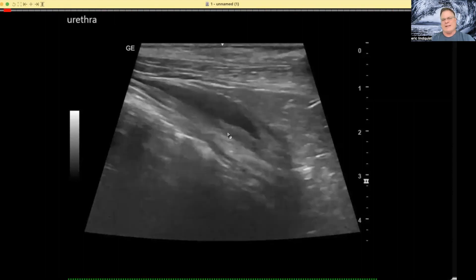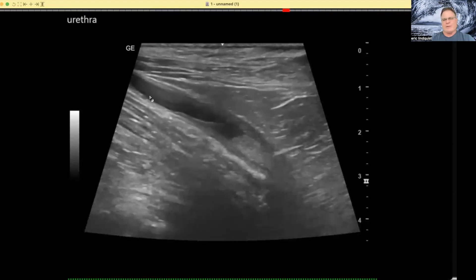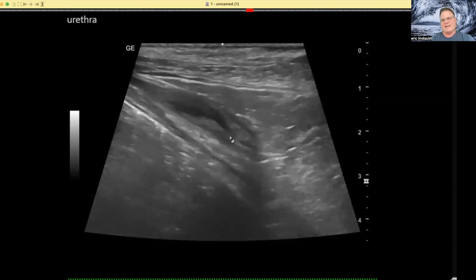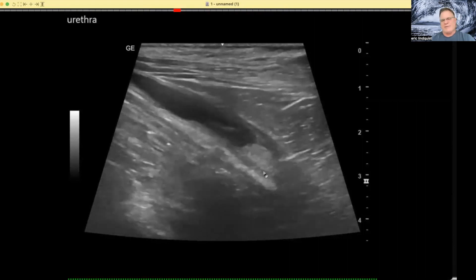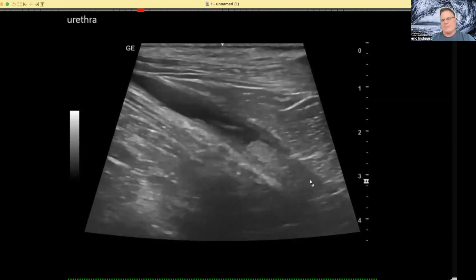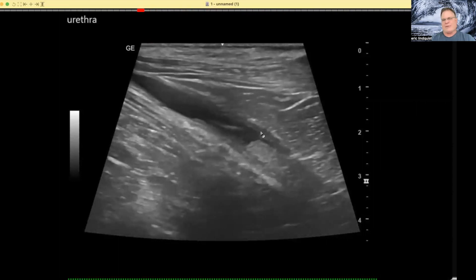As we get deep in that pelvic urethra, we have a progressive thickening of the urethral wall. Normal here, normal, normal — and as it progresses, it gets thickened, it gets irregular, and it forms an overt mass. Now we're down into the end of the urethra. The colleague did a great job getting in about five centimeters of the pelvic urethra in this female. You can see the tumor sitting right there — classic transitional cell carcinoma, progressively causing a mass.